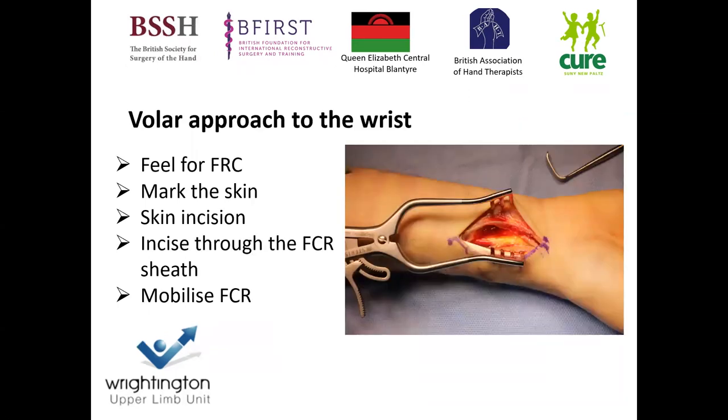I perform the volar approach to the wrist. I feel for the FCR and the longitudinal axis of the wrist, then mark up a skin incision of four and a half centimeters in length based upon the FCR, going from the proximal wrist crease coming proximally. I then incise through the FCR — you can take the FCR either radially or ulnarly. In this situation we've taken it radially, so the FCR is aiding in protecting the radial artery, but you need to be aware of the nerve structures at risk on the ulnar side of the FCR.